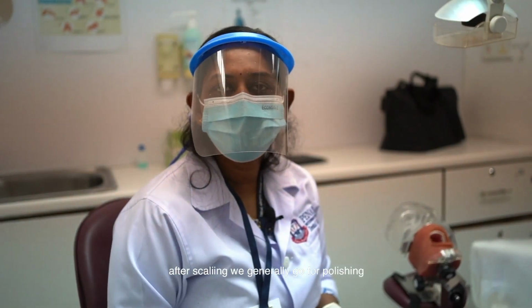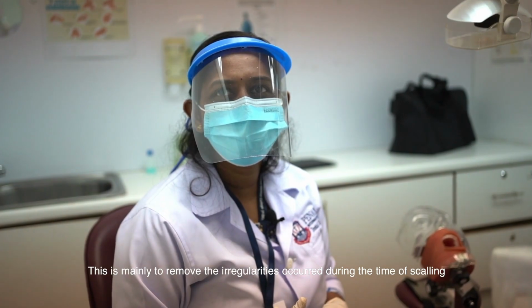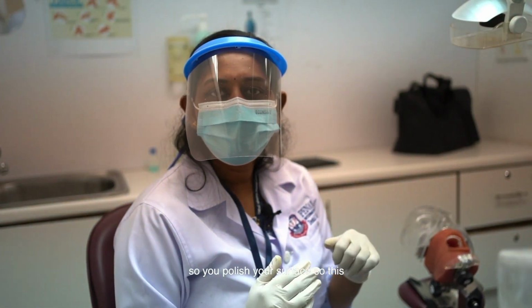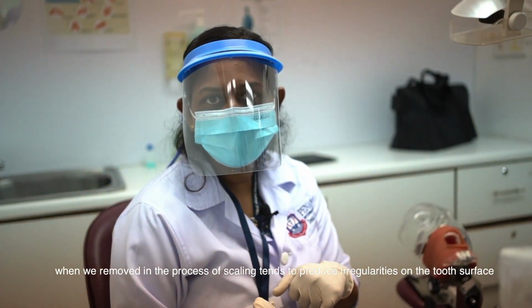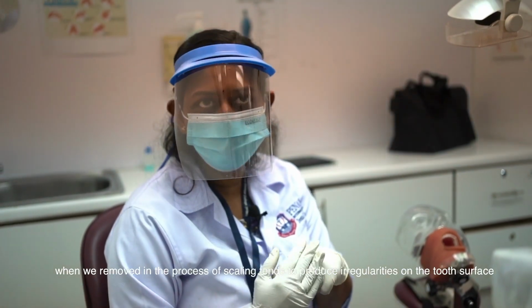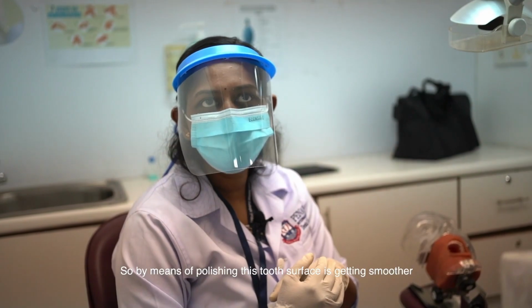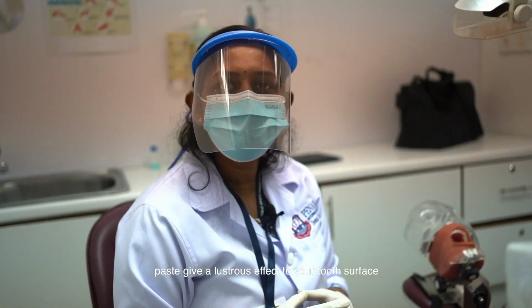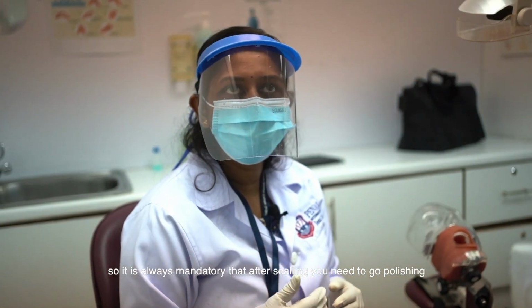After your scaling, we generally go for polishing. This is mainly to remove the irregularities which have occurred during the time of scaling. So you polish the surface, because the calculus which is stuck on the teeth, when we remove it during the process of scaling, tends to produce irregularities on the tooth surface. By means of polishing, this tooth surface gets smoothened. So that is the reason why we do polishing, and this polishing paste also gives a lustrous effect to your tooth surface. So it is always mandatory that after scaling you go in for polishing.